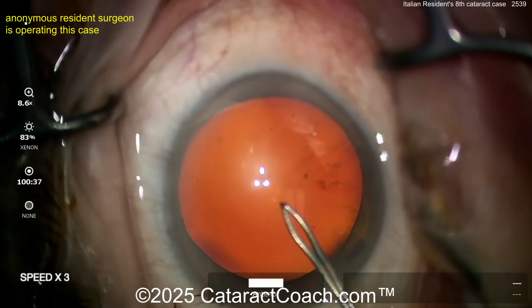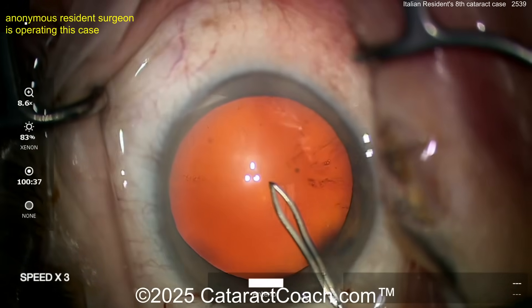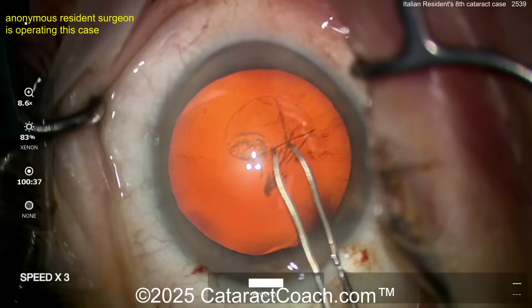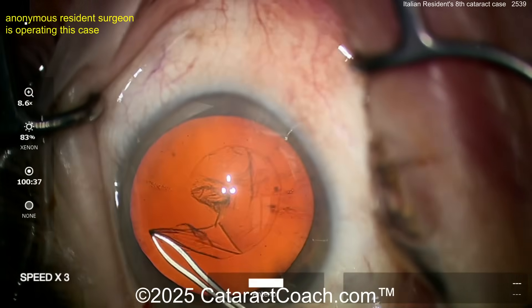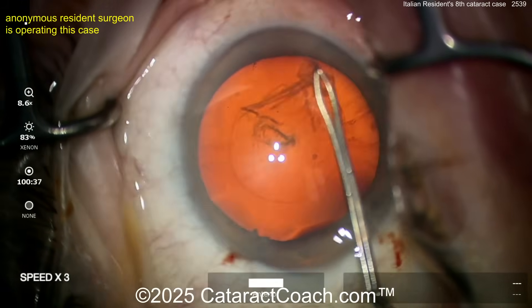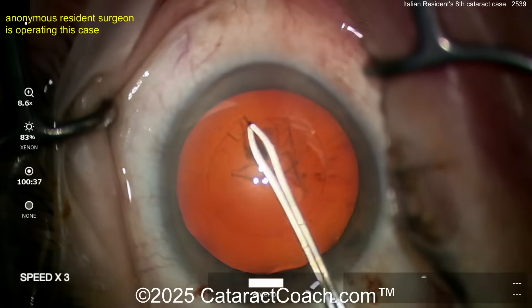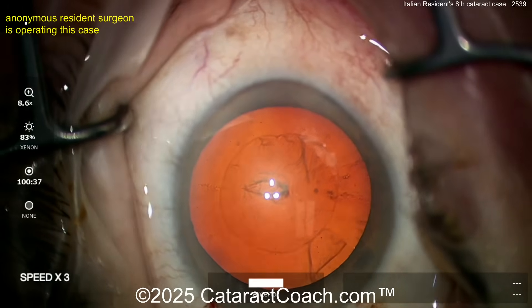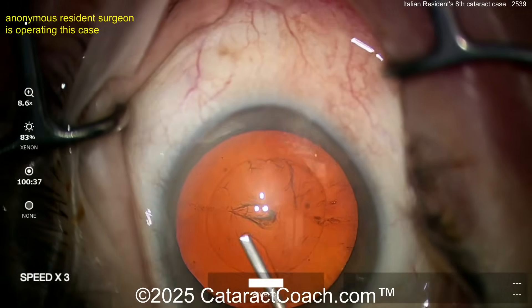Let's see the rhexis here — using forceps only, no cystatome. Look at case number eight. Let's watch the rhexis. Beautiful. This is amazing for case eight. You may say this isn't case eight, but why would they be dishonest? I'm not putting any names there, no one's getting any credit. That's a beautiful rhexis for case eight — I cannot even believe it.